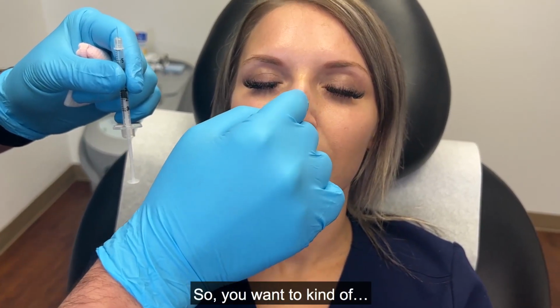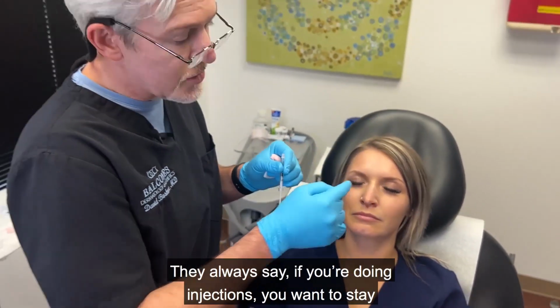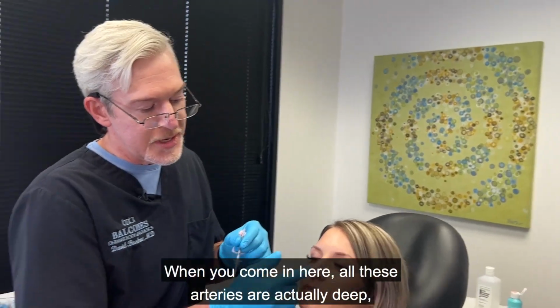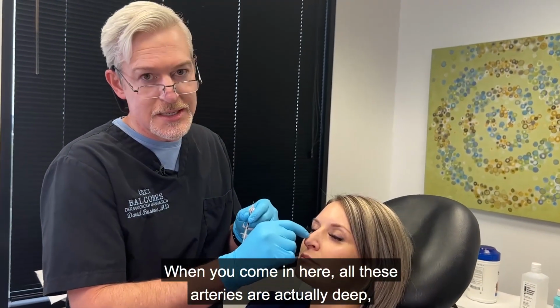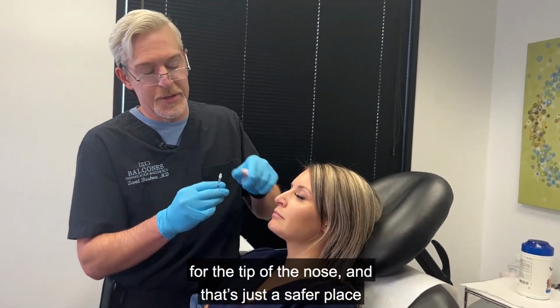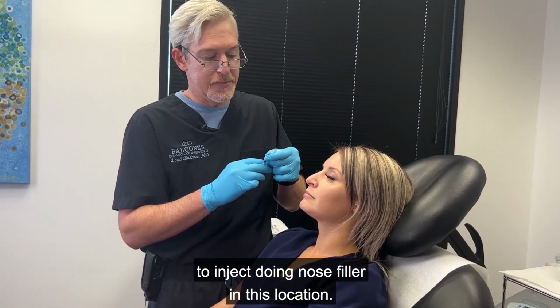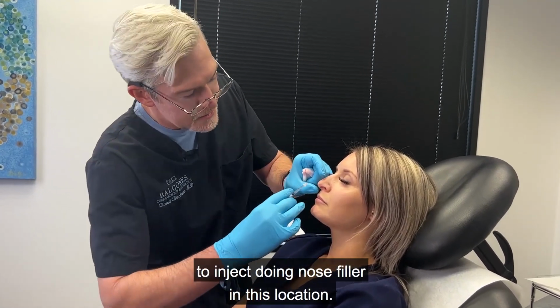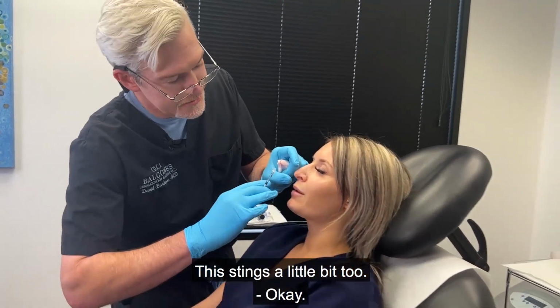So they always say if you're doing injections, you want to stay midline as much as possible if you're on the dorsum. When you come in here, all these arteries are actually deep. So we want to stay superficial when we come in here for the tip of the nose, and that's just a safer place to inject for doing nose filler in this location. So this stings a little bit too. Okay.